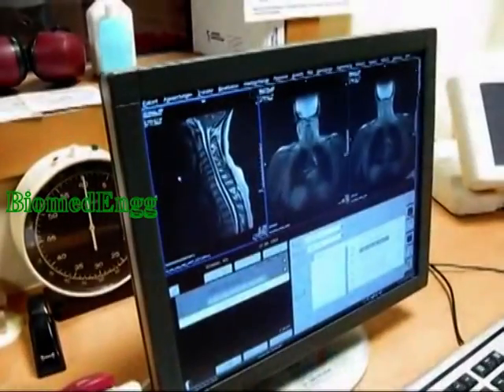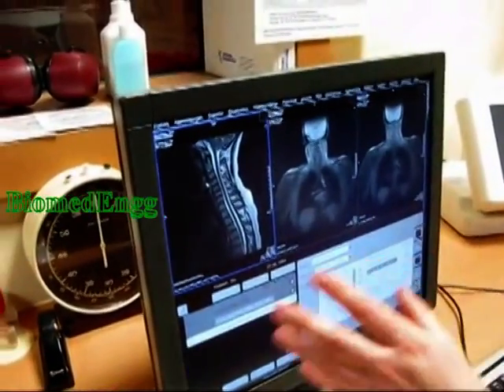The measurement will take about 4 minutes. Every sequence has a different sound — this is the sound of this sequence. This is the final scan, or one sequence of it.